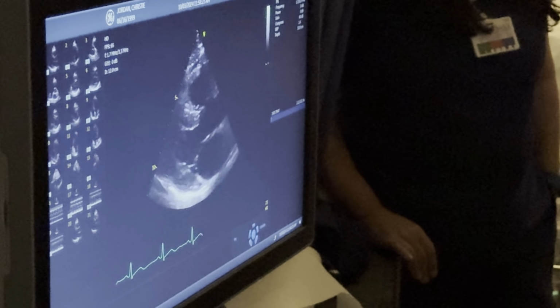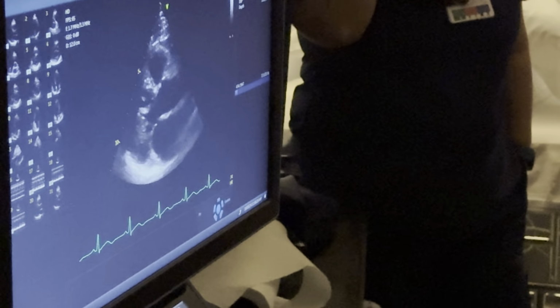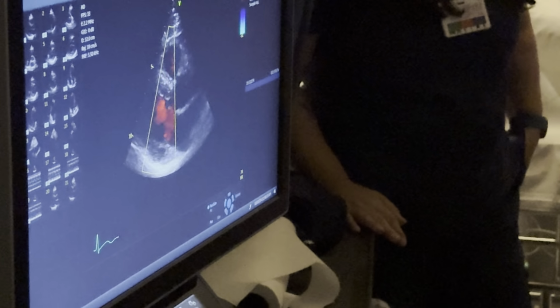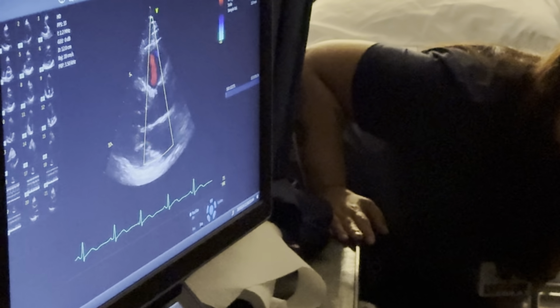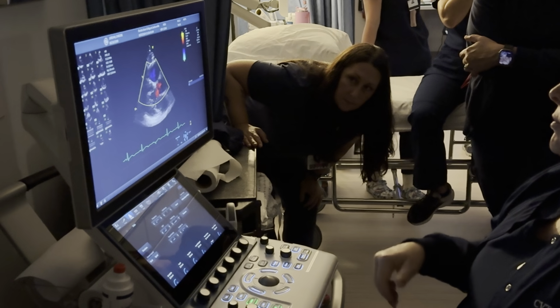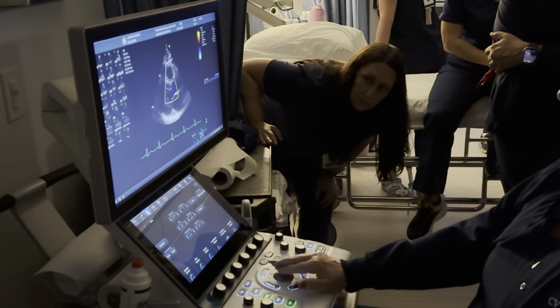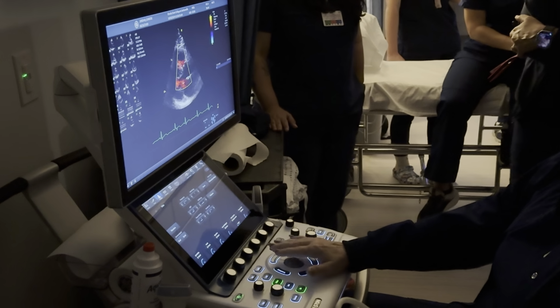Okay? All right, one last thing that I'm going to talk to you about is where to put this region of interest, but you just hit color, and here's your region of interest. If you hit one of these enter buttons, you can make it wider and shorter. The issue with frames per second is the wider you go, the lower your frames per second are. So I don't want to go very wide. This really doesn't make that much of a difference, but I don't want to go very wide, okay?